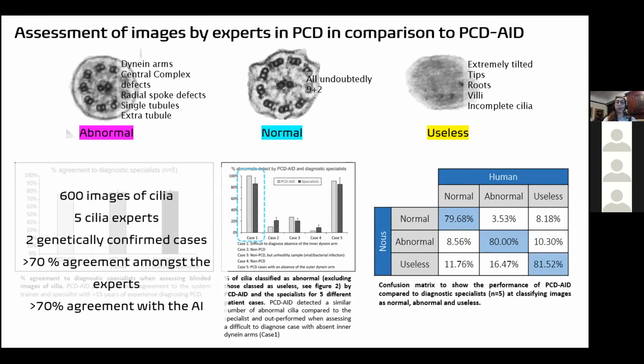Again, we had a very high agreement, and now we are also auditing our other project, the one that classifies into defects, and that one is more complex. In that one, we need a bit more analysis, but I can tell you, despite the fact that the agreement in some defect classifications is a bit lower, it's still very high. It's still very similar to what we see here, which is very optimistic, taking into account that that project is still ongoing and we still have to give it more images and more numbers.